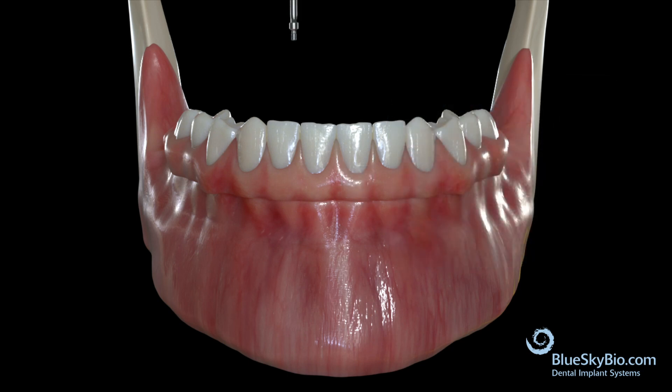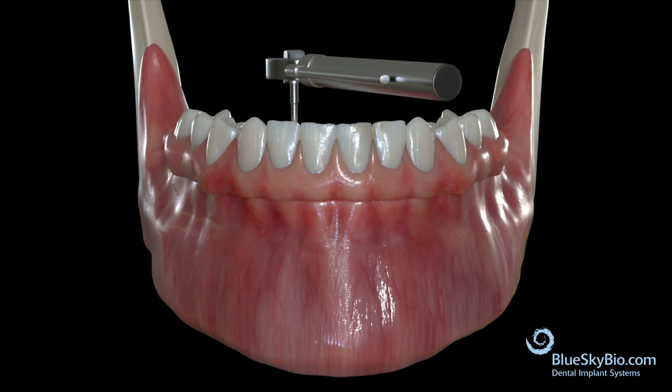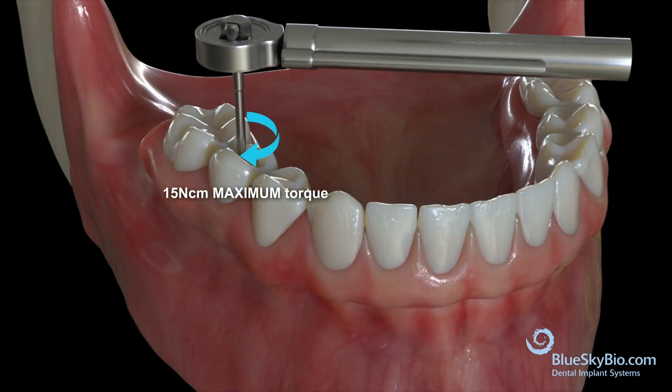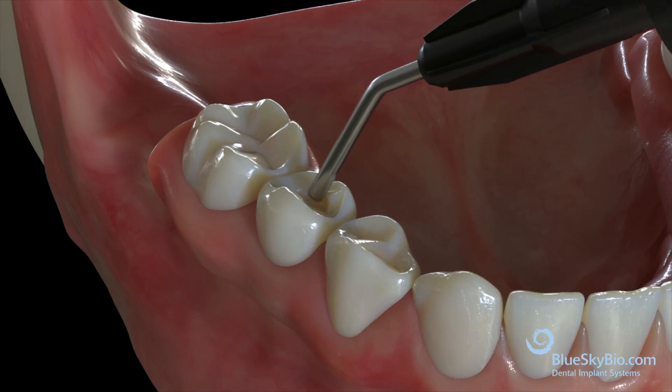Seat the final restoration in the mouth and confirm again that it has a passive fit with clinical evaluation and with radiographs. Each screw should be torqued to a maximum of 15 newton centimeters. Place Teflon over each screw hole and then fill the remainder of the access opening with composite resin.